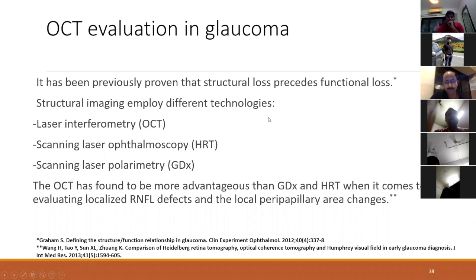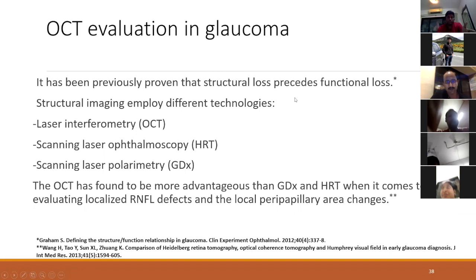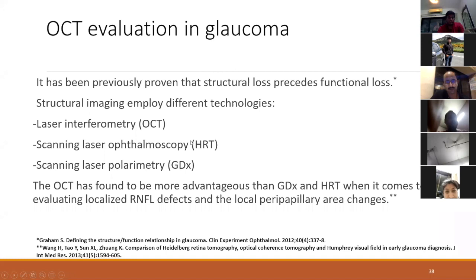For structural evaluation with OCT: three main analyses are used for glaucoma detection. First is RNFL analysis, which is the most accurate. Second is optic nerve head analysis. Third is GCC (ganglion cell complex) or GCL-IPL analysis. The Zeiss Cirrus will be used to explain how to interpret OCT reports.